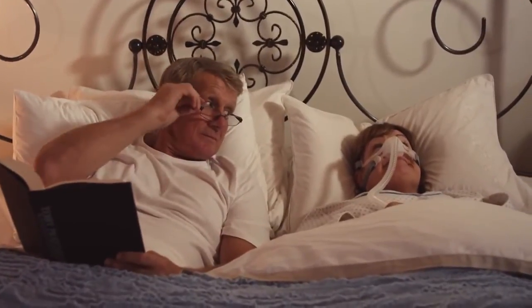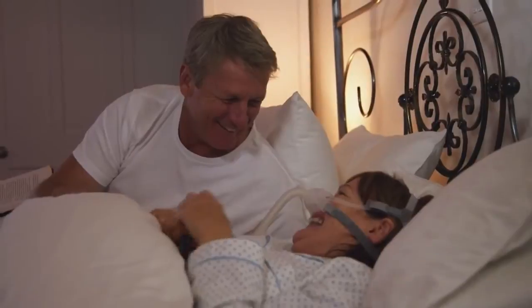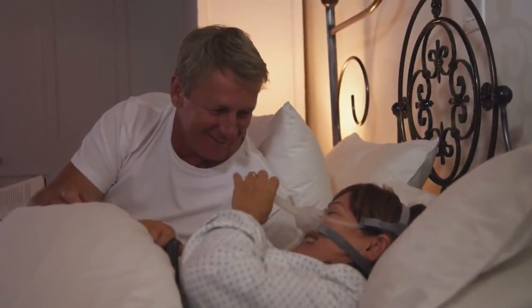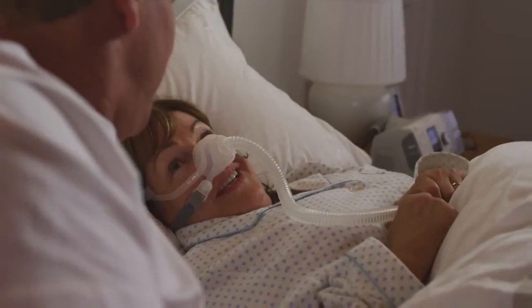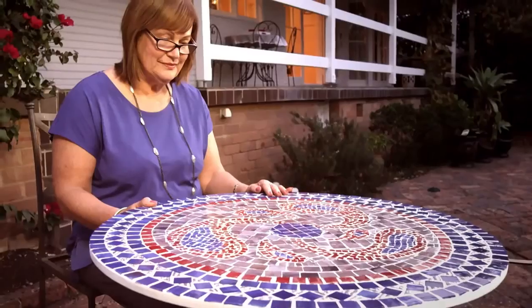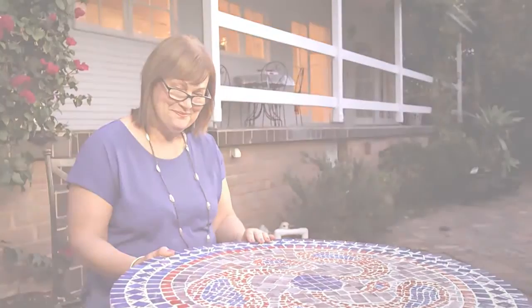I can rarely sleep without my machine now — I am so used to it. I'm comfortable at night and my husband sleeps well next to me. I get quality sleep. What felt awkward at first now feels quite normal. I'm Pamela and I've been getting great sleep since 2001.